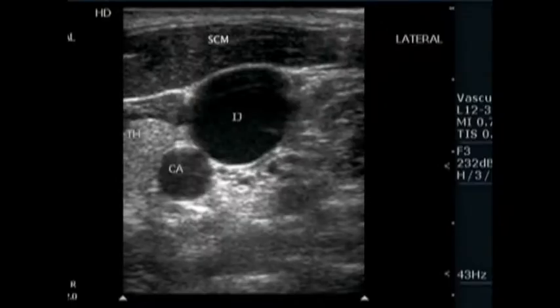As we all know, the vascular anatomy can be somewhat variable, and sometimes external landmarks can't be seen or felt. So with ultrasound, we use the same approaches, but we can actually see the underlying anatomy and guide our needle into the vessel, eliminating a lot of poking around in the patient's neck.